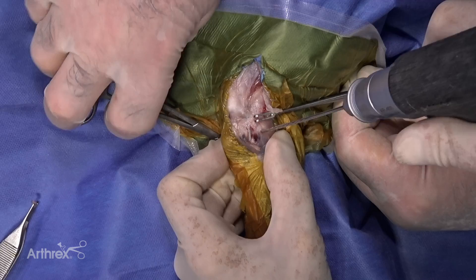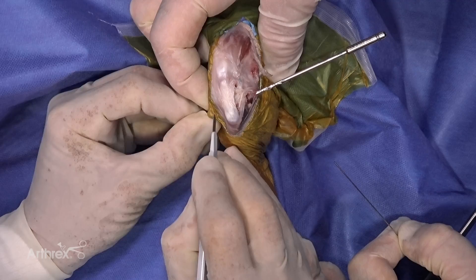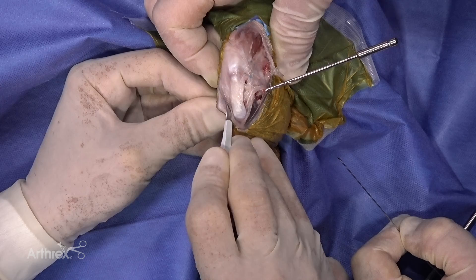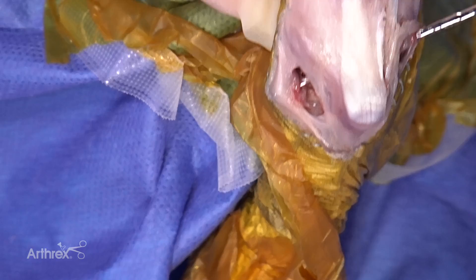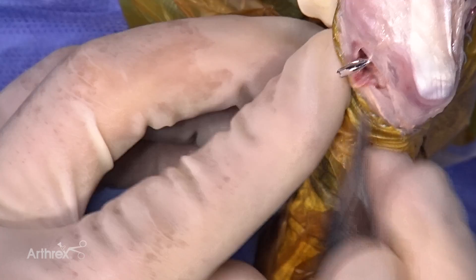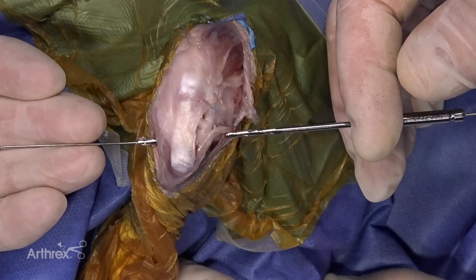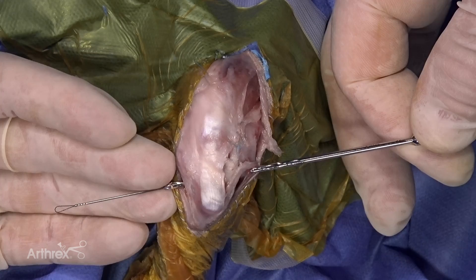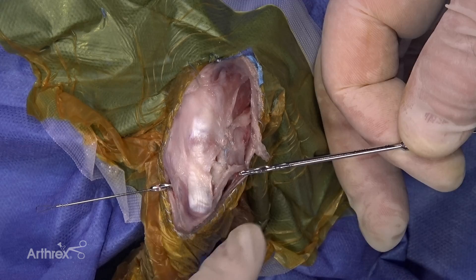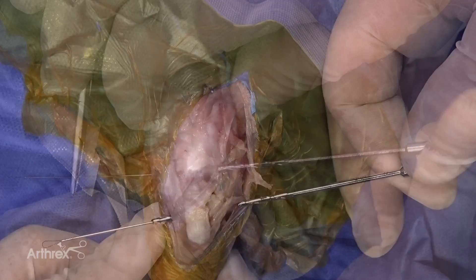The K-wire is acting as a guide. We're going to make a small incision medially just over the exit point of the drill bit. That's the caudal belly of the sartorius muscle — you can see the exit point where the drill bit is coming out. It's very important to remove soft tissue from the exit point because all we want is the button sitting next to the proximal tibia with no interposing soft tissue. Now we're going to take a nitinol suture passer and place it in the cannula of the drill bit. It's very important to remove the drill bit — if you forget and try to pull the suture through you'll break the nitinol suture passer.